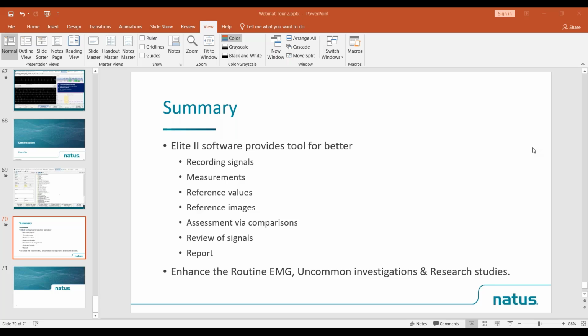Yes, and they come from a publication from Clinical Neurophysiology. Those are IFCN guidelines. That article can be found readily on the internet.